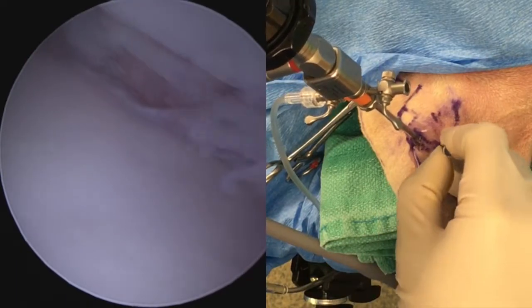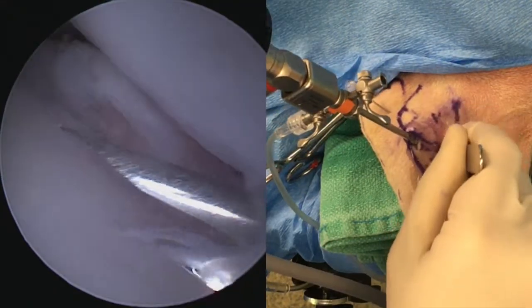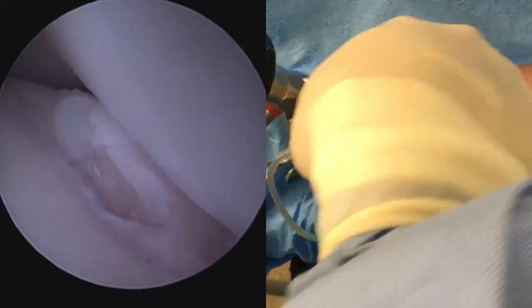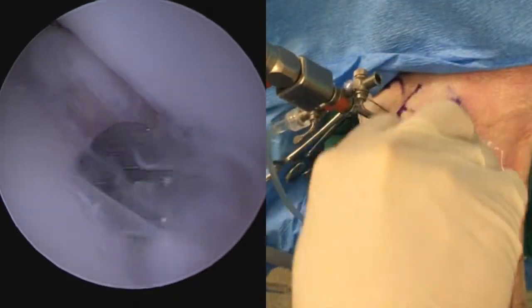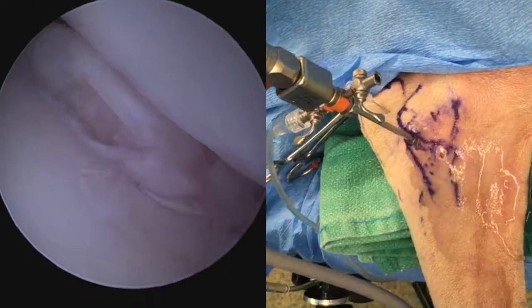We now create the instrument port, approximately 1 to 1.5 centimetres cranial to the scope port. This is done in the traditional manner with a needle first to confirm placement, then with an 11 blade, expanding that hole with a pair of straight mosquito hemostats to create a nice wide channel for the instrument port.